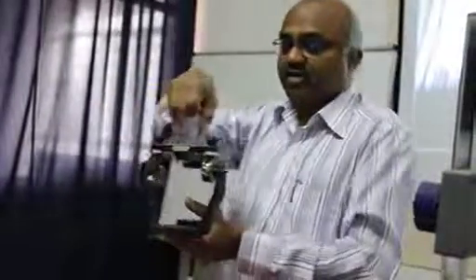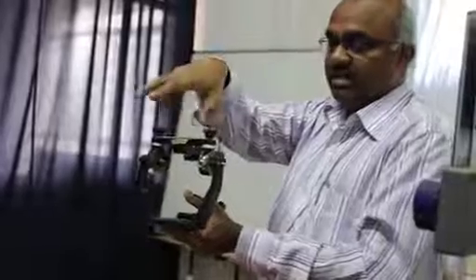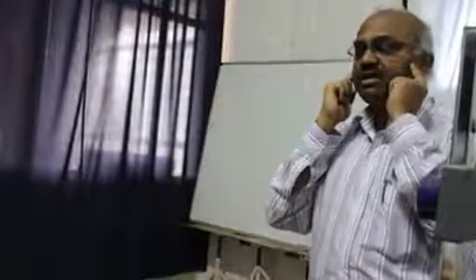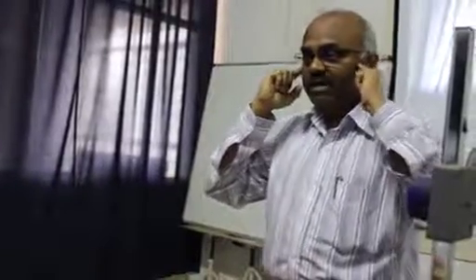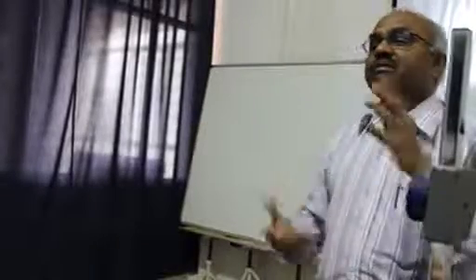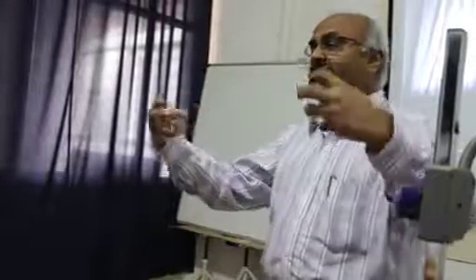There are some articulators where we can change the intercondylar distance. This distance can be changed. It will not be the same. The distance between two condyles is not the same for everybody. It just differs a little bit. Understand? Many things differ from person to person, not only the horizontal distance between each condyle, but each condyle differs in so many ways. One may be up, down, a little bit here, there. For all those things we have to use the fully adjustable articulators, wherein we take a lot of graphical representations from the human being and then transfer them onto a device which will give you all the positions of the condyle in relation to the fossa.